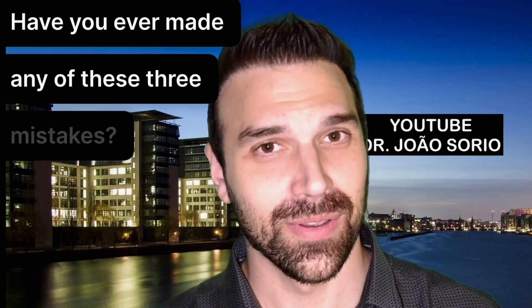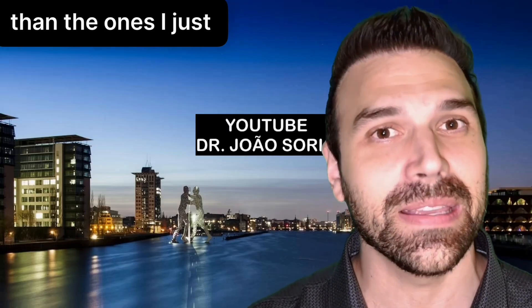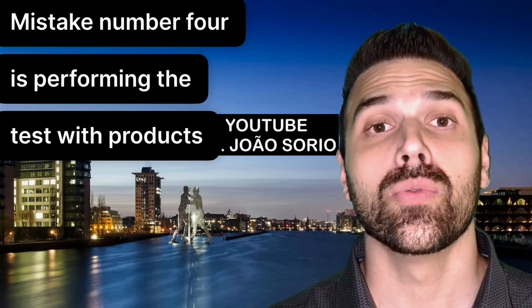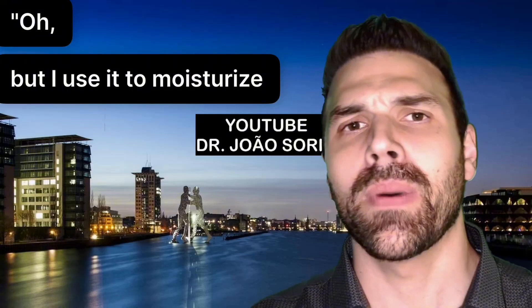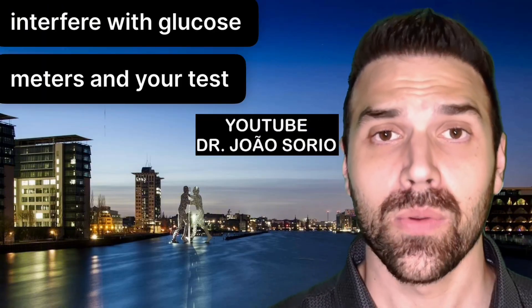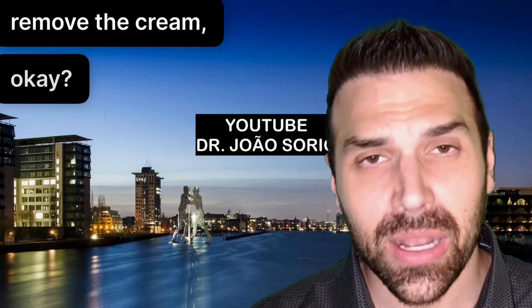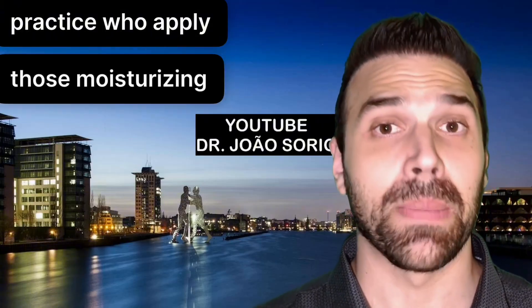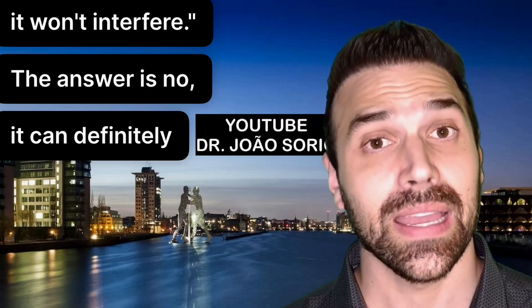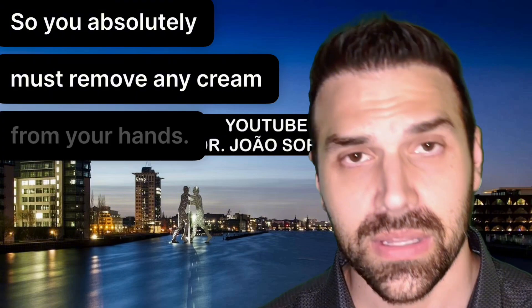Have you ever made any of these three mistakes? Mistake number four is performing the test with products on your hands, like creams. Many creams interfere with glucose meters and your test results, so you need to completely remove the cream. I see many people in practice who apply moisturizing creams and think it won't interfere — but it can definitely give you a false result.